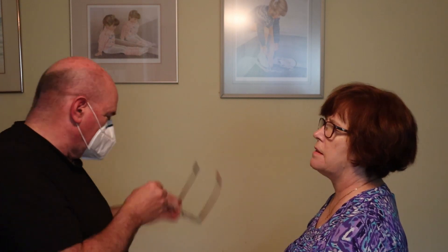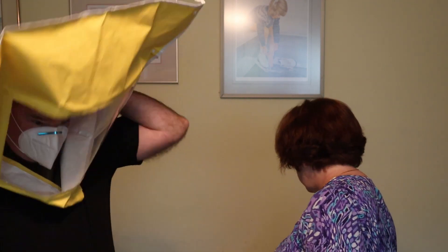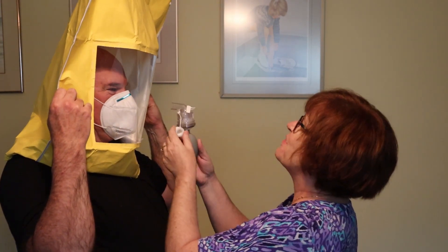I can tell you right now, this is a very closed space — this is a small kitchen we're doing this in and I'm already tasting it. But the reason I saved myself for last is because I know that when I go to do this test, I'm going to notice a difference if the mask is leaking. I'm going to really pinch it good because I'm hopeful. The problem is that the elastics aren't holding it tight enough. So it's this solution right here that you want to use — just start squirting it in. I want to make sure I get the right one — the one that smells really wonderful.